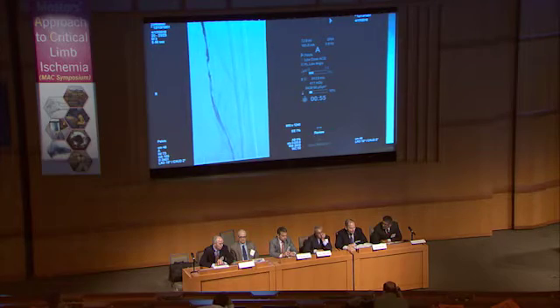But if you're dealing with the AVM, which is what you're doing right now, I think you're going to have to probably consider embolizing some of the branches from the profunda once you put the stent graft into the SFA. That's what I was thinking. Is there an option of, say, proximal ligation or something? Surgically? I think dealing with arteriovenous malformation surgically is extraordinarily difficult. I think a lot of those cases ought to be done endovascularly.